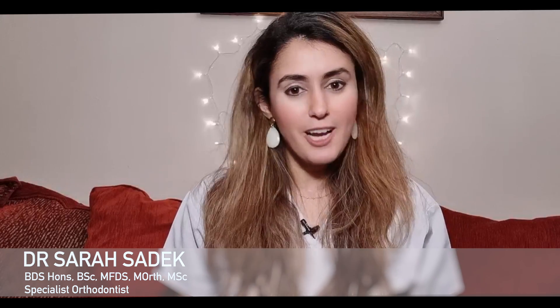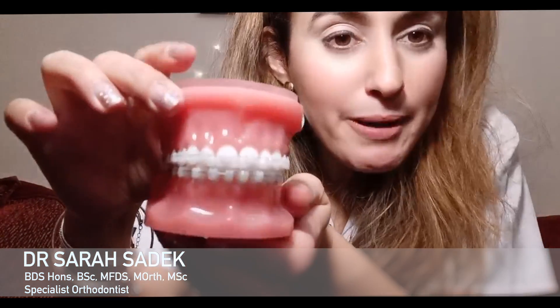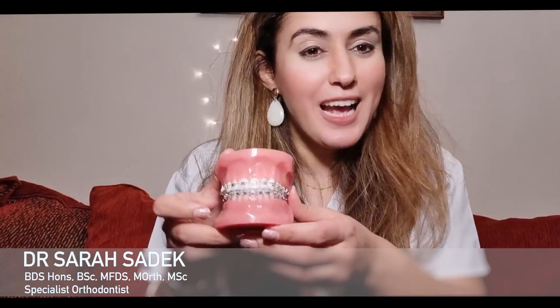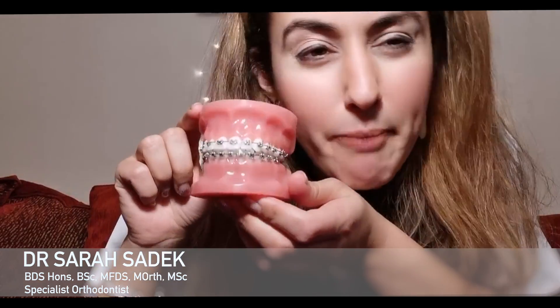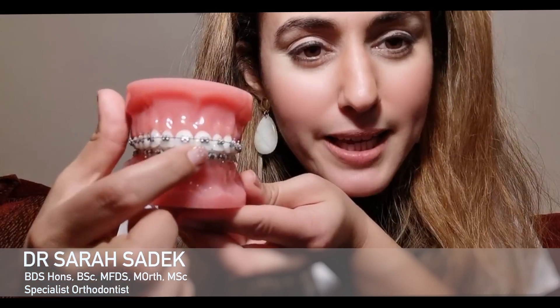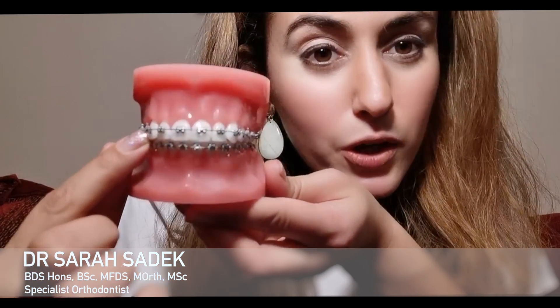Braces come in lots of different types and I'm just going to show you a few of them. Really, the procedure itself doesn't vary too much with the type of brace you have. These are ceramic or white braces. The other type of brace you can have are the traditional metal train track braces that have been around for ages, with metal brackets and the wire going through them.